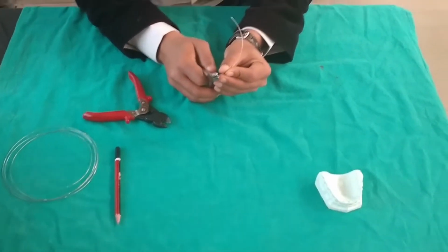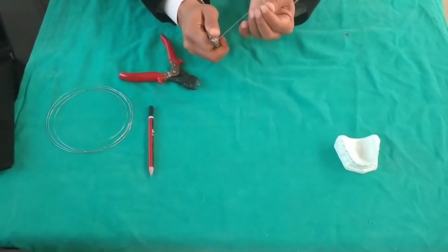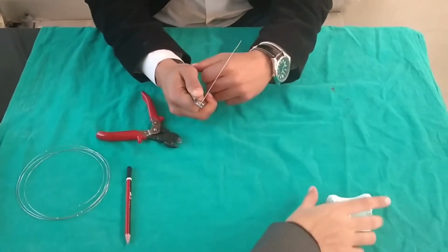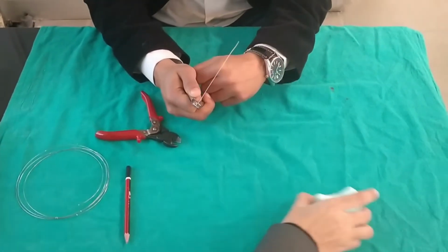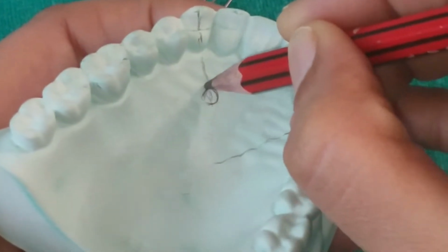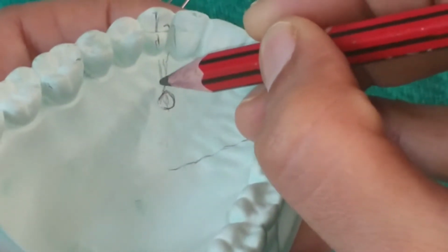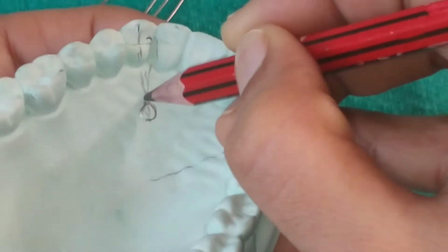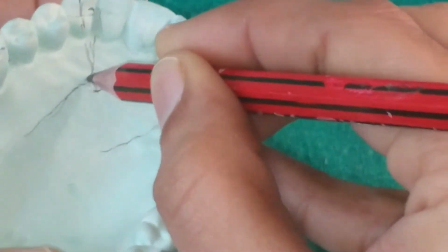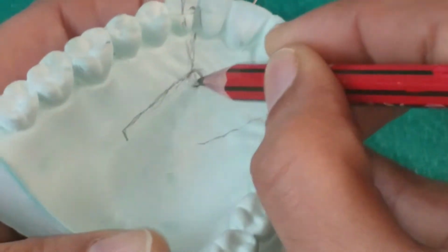For a palatal canine retractor, we need 0.6 mm stainless steel wire, straightening it up. It consists of a helix in the axis of the canine, and the active arm engages the mesial embrasure or is along the mesial side of the canine, and the retentive arm is long and parallel and engages the acrylic. It is a supported kind of spring.